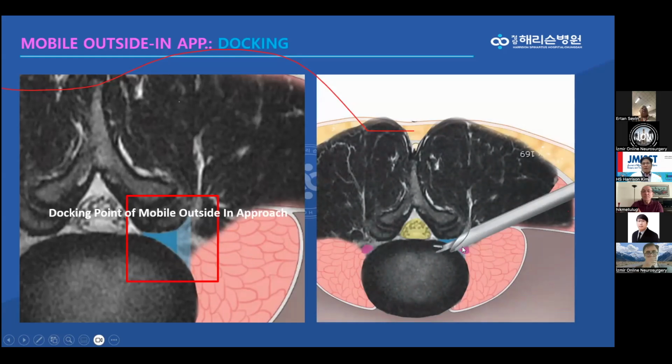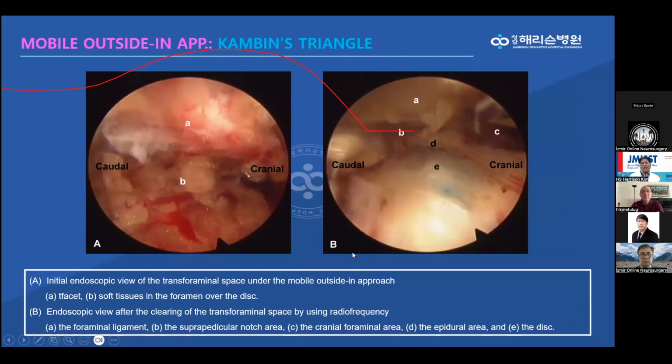I already mentioned that in the conventional posterolateral transforaminal approach, you usually make a 25-degree or 30-degree angle. This is very safe from visceral injury and dorsal root ganglion injury. Anyway, this angle is not easy for approaching the target point, so sometimes it needs some foraminotomy.